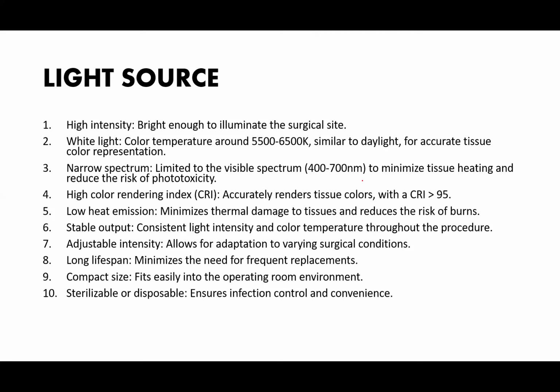That is the idea of the light source. However, if you have a very roomy cavity, you require more light. If you have a bigger cavity, you require more light. And to get more light, you use larger caliber telescopes.